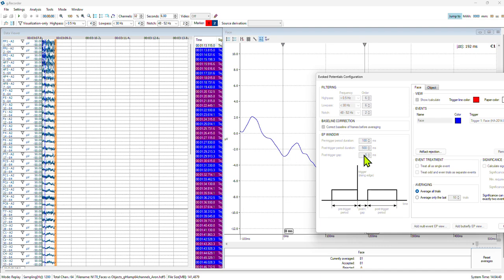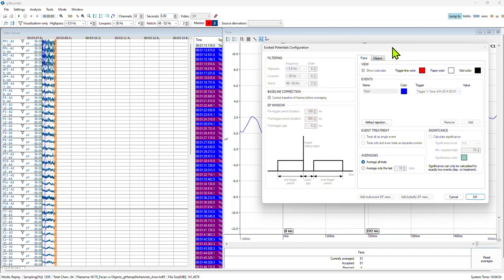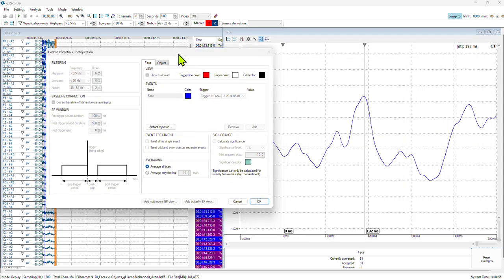Unfortunately, you cannot change this during the acquisition, so maybe you can go with more conservative numbers, and then you look for the P60 maybe, and 100 and so on. That should be enough. Or maybe you can also try just a 15 millisecond gap, and then look for the P25 or whatever other peaks you're interested in.